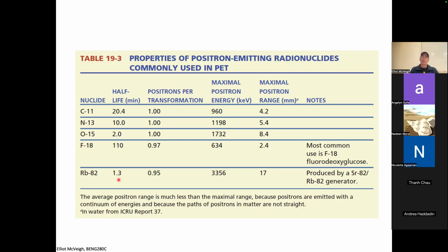So most of your imaging, you can see an uptake and a washout with that agent. This water agent is also 2 minutes, very rapid. And these are somewhere in the middle, and this is really long.